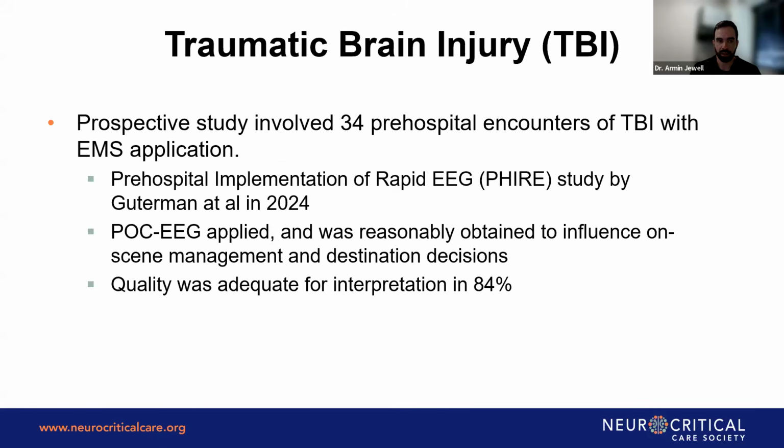And this actually came into a study just recently done in 2024 called the FIRE study. So they actually had EMS workers and EMS trained people using these point of care technologies. They had the technology in the ambulance with them.